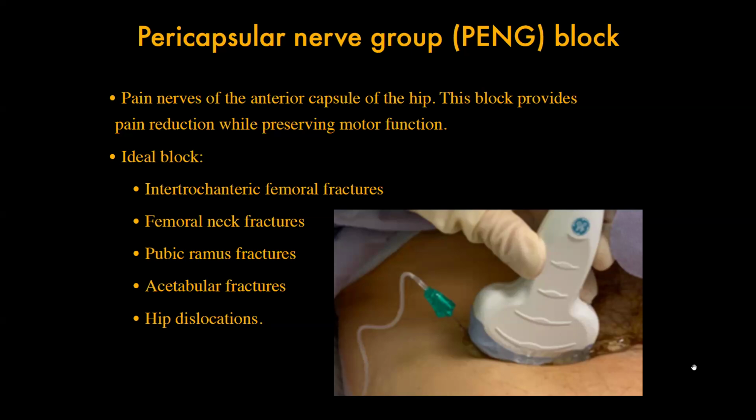So I think people love to come up with new techniques. They love to get published. They love to talk about it at the conference, but a lot of times I've noticed that those blocks fade away and you never hear about them again.